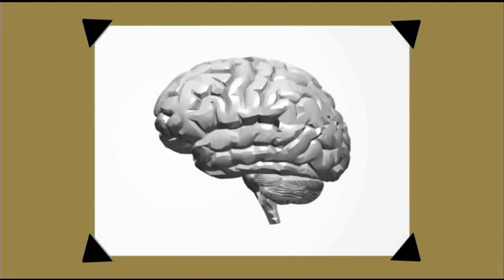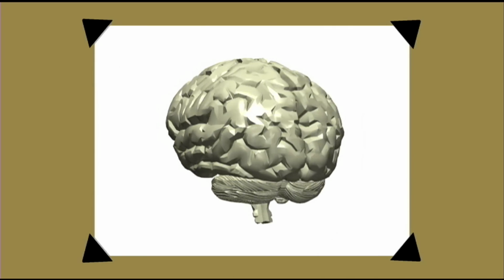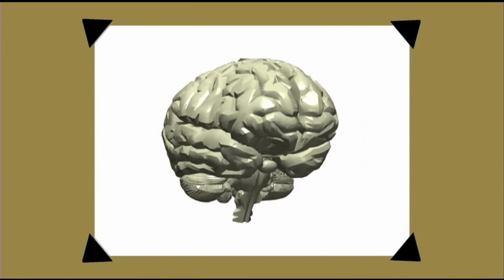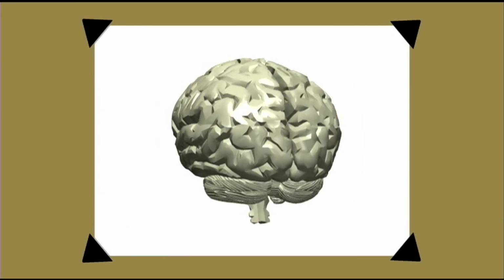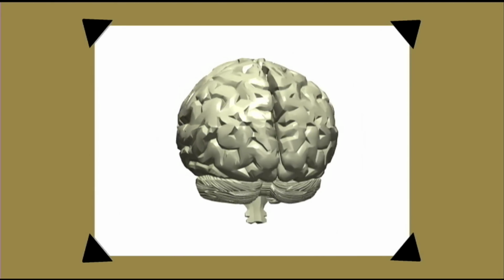However, the general population still clamored for new images depicting X-ray images of body parts, such as this foot in a shoe acquired sometime near the turn of the century. The ultimate prize in this unofficial worldwide contest was the first radiographic picture of the living human brain. We now know that because of the limitations of the standard X-ray image recorded on a photographic plate, this elusive picture of the brain was impossible with the technologies available in the early 1900s.